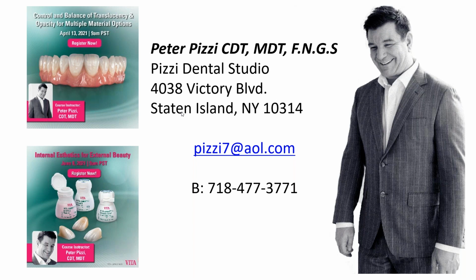So sometimes it's an easier path to go than to pull out 3 more bottles of powder. I already put down the color that I wanted. I just want to manipulate it a little bit more to get a little bit more chroma or a little bit more fluorescence or value out of it. So yes, I do that quite often. If you would ask me that question a year or 2 ago, I would have probably said I do it for dropping value in translucency, but I don't anymore.